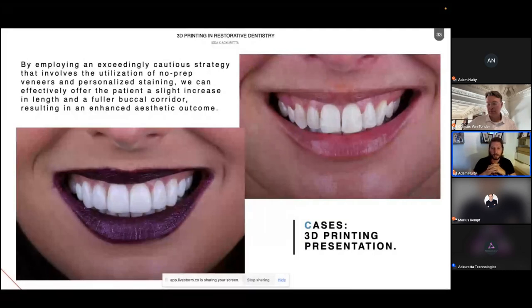And, you know, a stent becomes a bit of a faff in terms of placing, either ones with metal strips that you have to really carve to get those embrasures right, or indeed using things where you have to use PTFE tape and then the stents on and off. Those cases are not what I want to do and what I want to spend my time with.